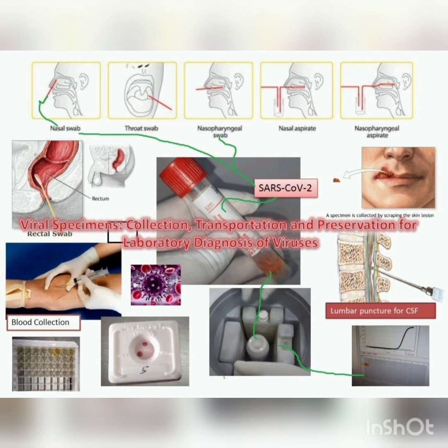And if it is a viral infection of the meninges and brain tissue, then you need to take out the cerebrospinal fluid. You will find the causative organism in the CSF. During the onset of the disease, in the initial stage, it is better. When the symptoms of acute illness have subsided, you may not find the causative organisms. So it is better when the disease starts, in the beginning, to take out the CSF for the study. That is the third point.